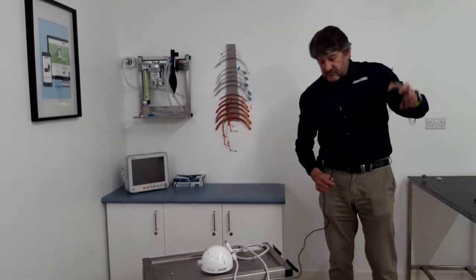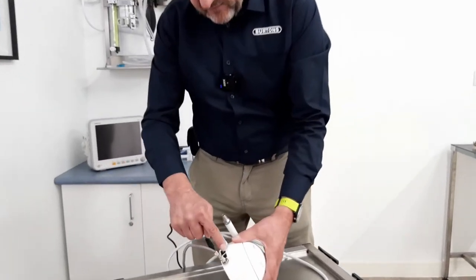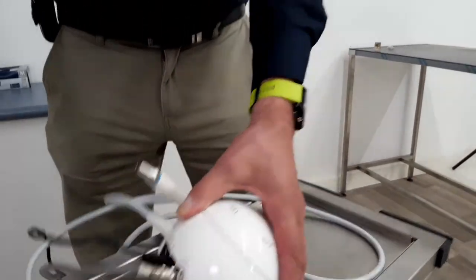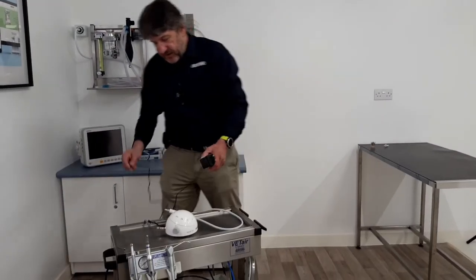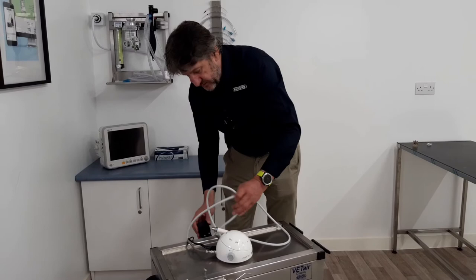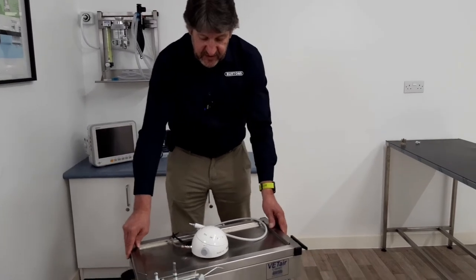The foot pedal to control the scaler connects into the back. There is a graphic guide, so just connect that like so. The power supply connects to the power supply hole in the back of the scaler and can be plugged into one of the accessory points. There are two accessory points on the back of the Vetter Classic, and there we have the scaler attached.